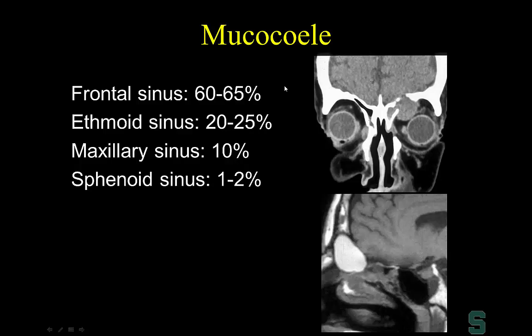Very chronic disease can form a mucocele, defined as complete obstruction of a sinus that also expands the sinus. A mucocele is well-defined, completely opacifies the sinus, and on non-contrast T1-weighted MR shows high T1 signal due to protein content. Because of intrinsic protein content, CT can show high attenuation giving an ominous appearance, as in this pathologically proven mucocele that eroded through the frontal sinus.